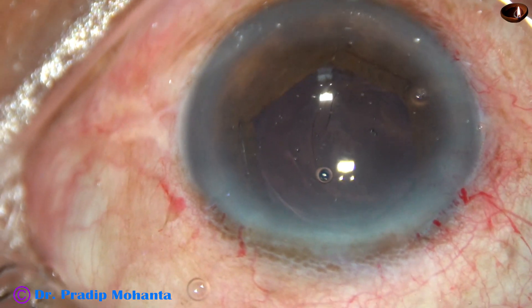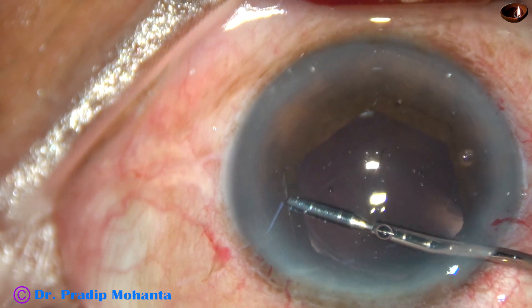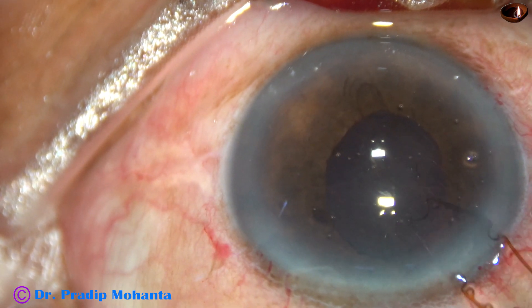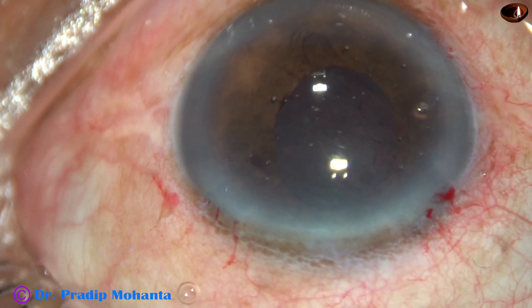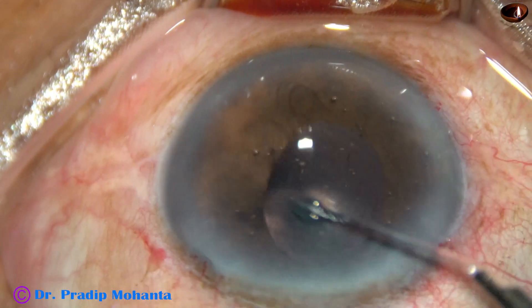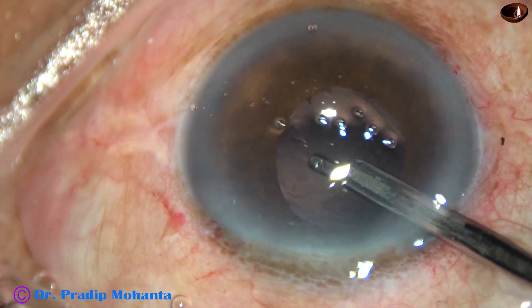Removal of the B-hex pupil expander is easy — just pull the device centrally, go above the iris, and all the flanges untuck. Hold a portion just in front of the main incision and pull it out. Now see, the pupil has taken its original shape. There is no sphincter tear. Now the viscoelastic substance has to be cleaned very nicely.